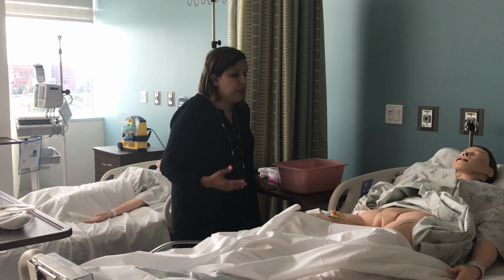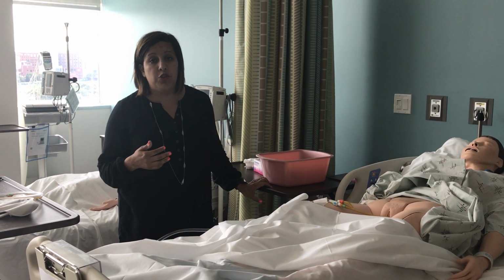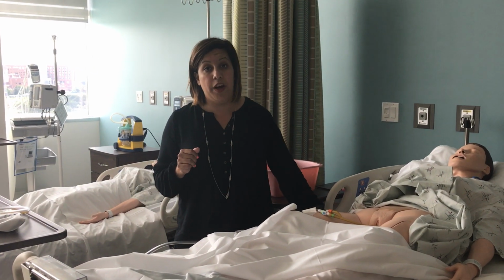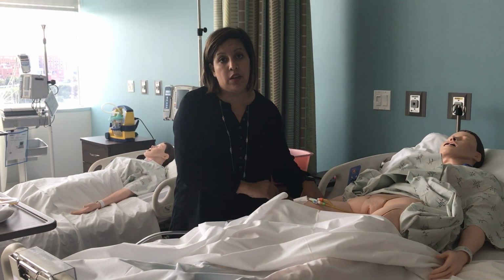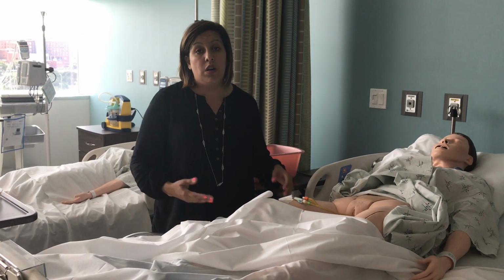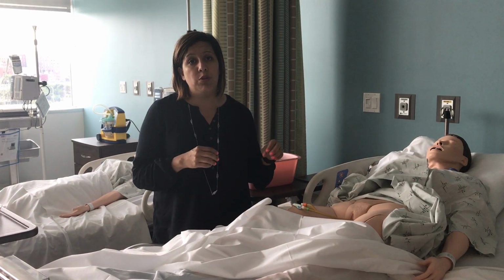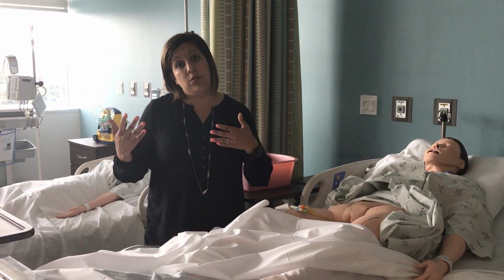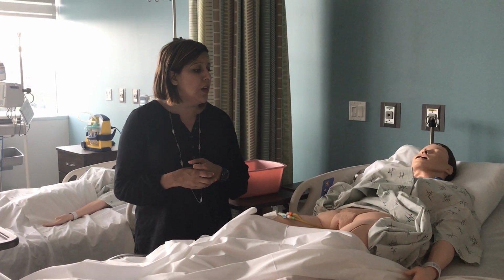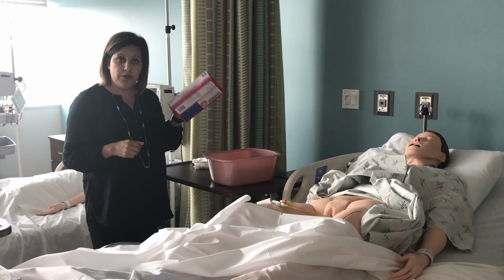Okay, so you're always going to do the beginning steps. Knock on the door upon entering. Introduce yourself to the patient. Always do the dual identifiers, so you always check their ID band. Explain to them what you're going to do. Of course, wash your hands. That's most important. If there are any family members in the room, tell them to leave the room, because you want to maintain privacy. So I wash my hands, and you want to make sure to put on gloves.